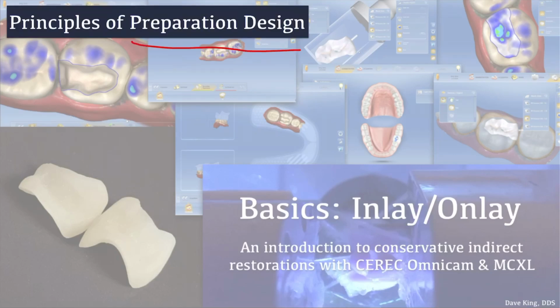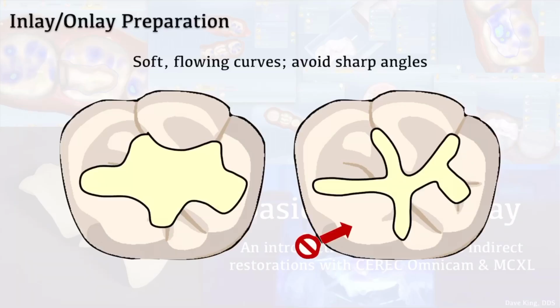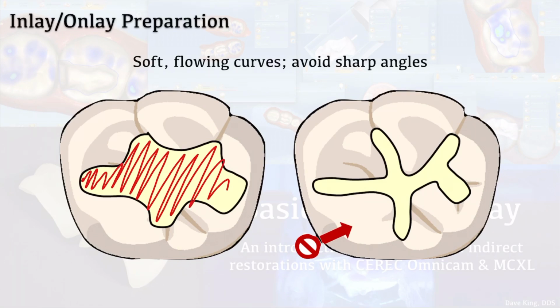Let's talk about preparation design. Avoid sharp angles. That's probably the biggest takeaway here. Avoid these sharp angles that you can see here. We want everything to be rounded and flowing, and the reason for that is, especially when we're talking about CEREC, you've got a burr that's going to be milling. Let's say this is the restoration, so we're going to assume that this is solid instead of a negative right here. The burr, which is a circle, has to go in and cut all these areas out from the outside, right? So it's milling from the outside.